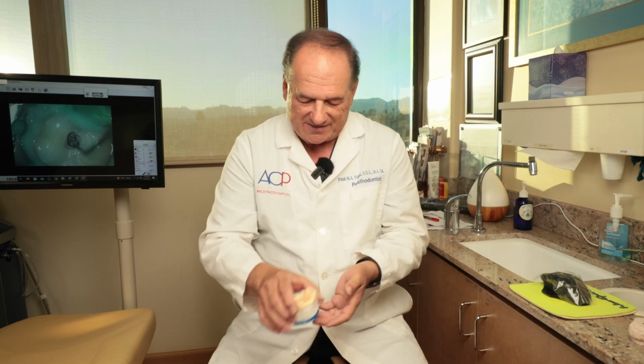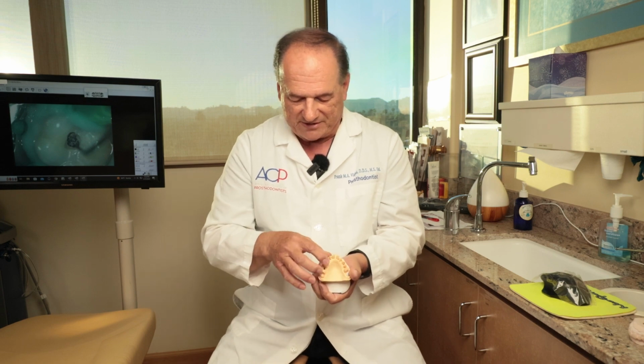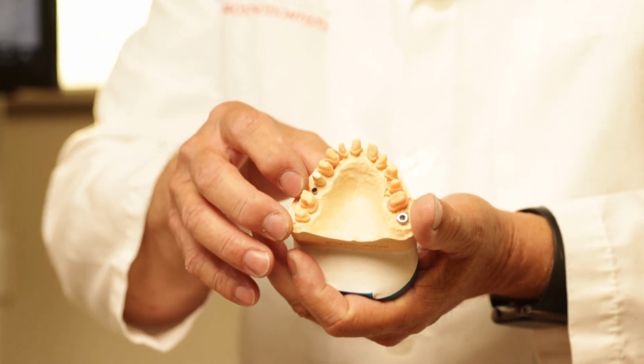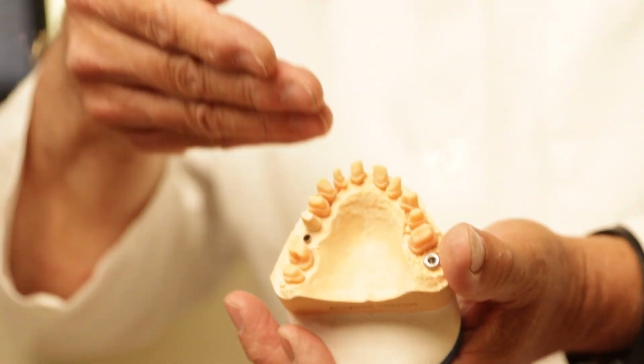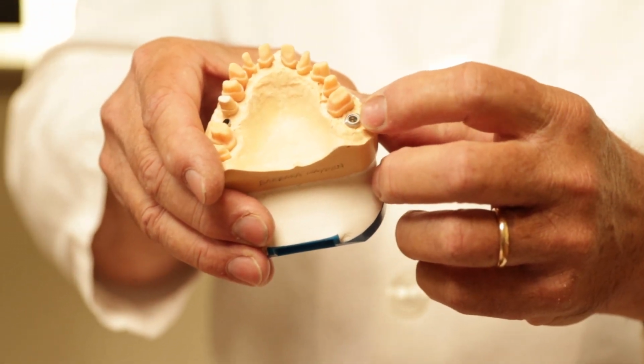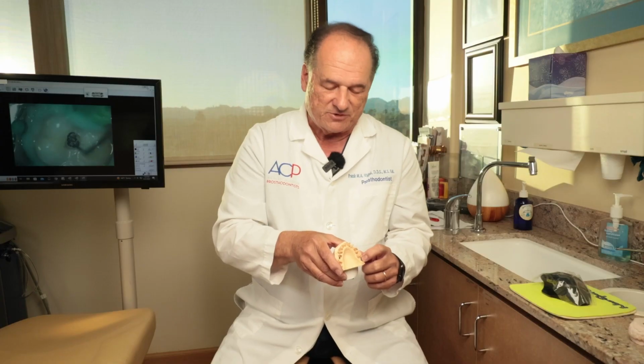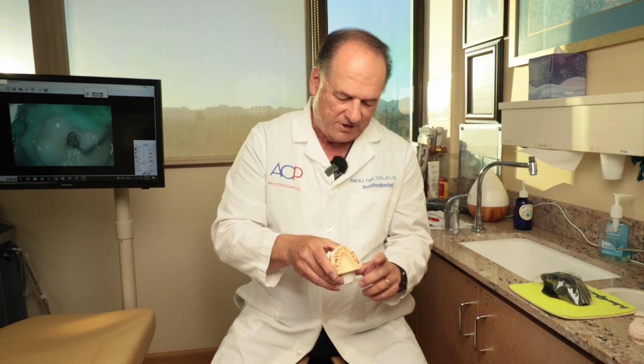Planning, again, is everything. Here's an example of a patient where we could have placed a bridge here, but to keep teeth separate, an implant was placed. Here, a molar in the very back, there is no option for a bridge.